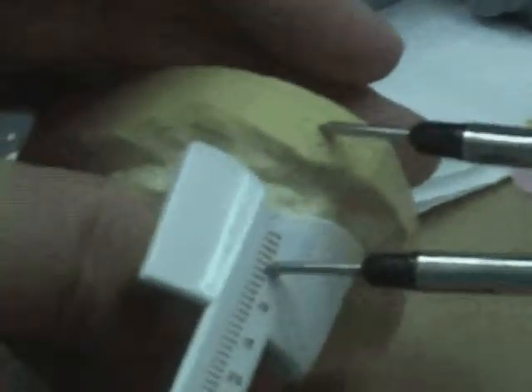And we have our compass that's going to measure down to, remember we had a 6 millimeter measurement, so we're going to measure down to 6 millimeters. It was 5.5, so we're going to go to 5.5, and that's our measurement.